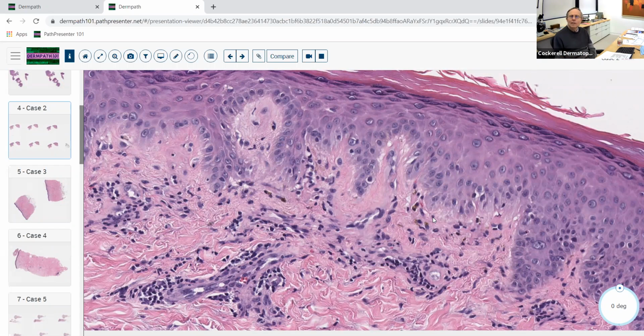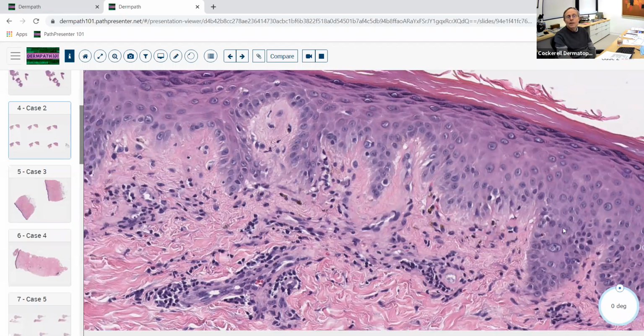There are a couple of things that can help you a little bit. This is dermatomyositis this time. If you biopsy a Gottron's papule of dermatomyositis, interestingly enough, it shows almost no inflammation. It shows some smudging and maybe slight thickening of the basement membrane zone. It's not like you see with discoid LE, but there's some alteration of the DE junction that you can see in a Gottron's papule, with dilated blood vessels and almost no inflammation. Surprisingly, you see a lot of redness and maybe that heliotrope color clinically, but when you biopsy it, there's almost no inflammation. So if you see that, you can think that it might be a Gottron's papule.